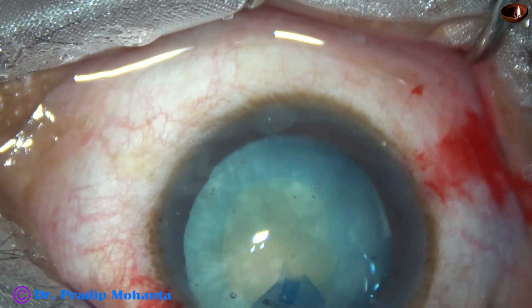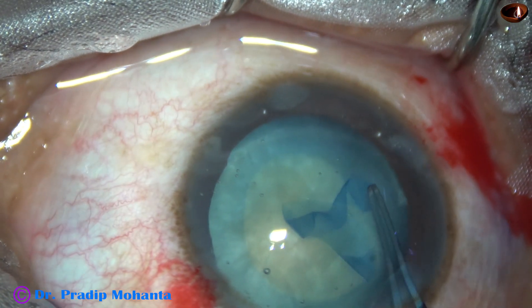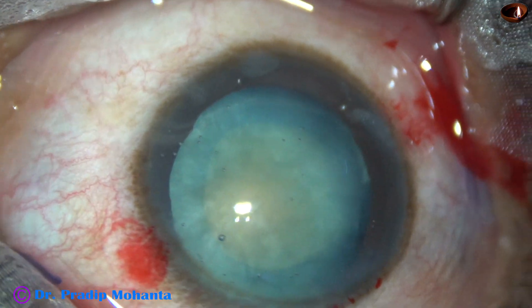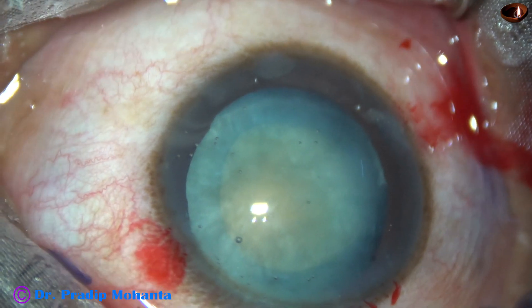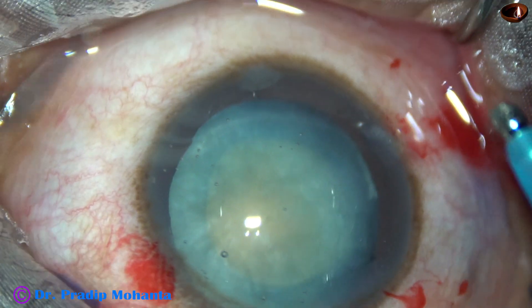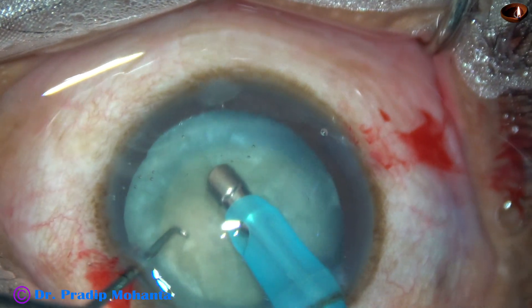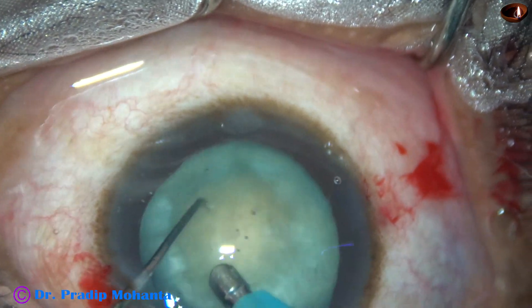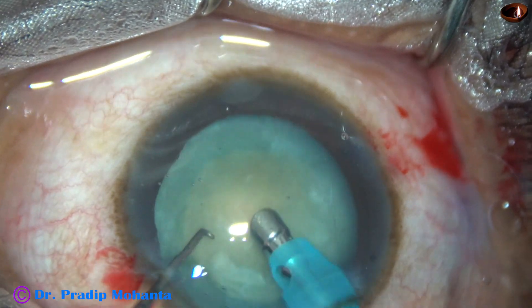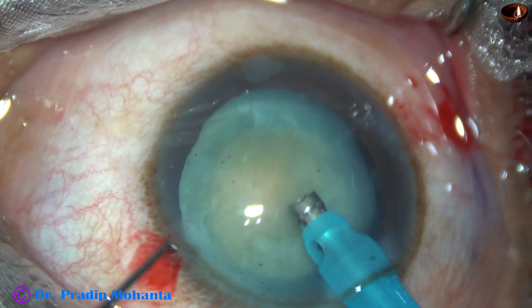In this case, the size of the enlarged rhexis is about 5.25 mm. Friends, if we can do this kind of rhexis in such cases, do you think we need a femtosecond laser? Actually, if we can increase our skills to a certain level, we don't need many sophisticated equipments. Many sophisticated equipments just take money from us — our hard-earned money is taken by the companies.